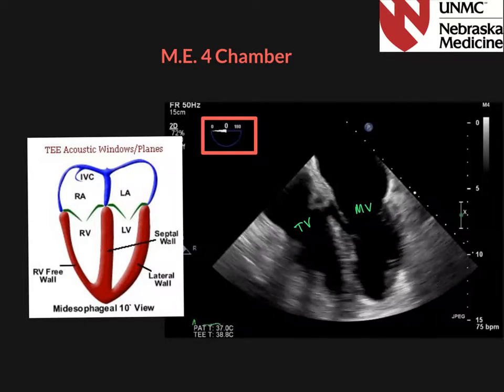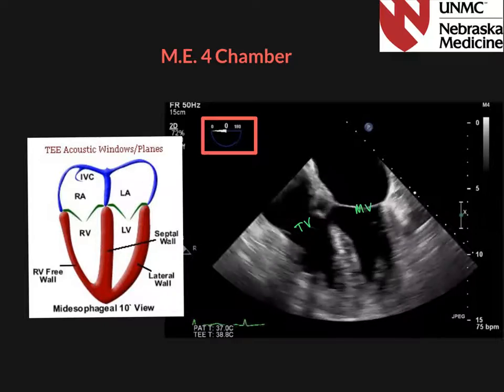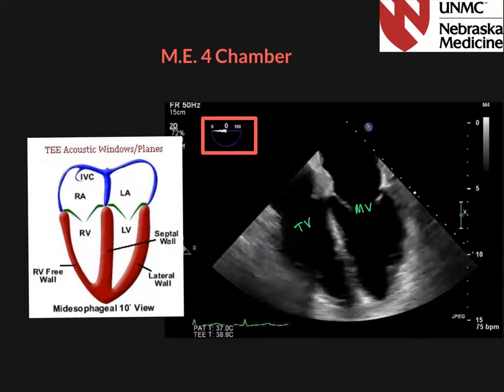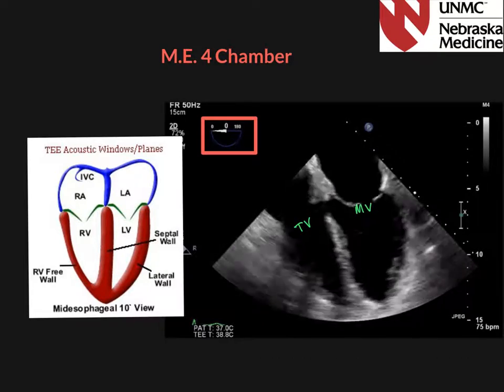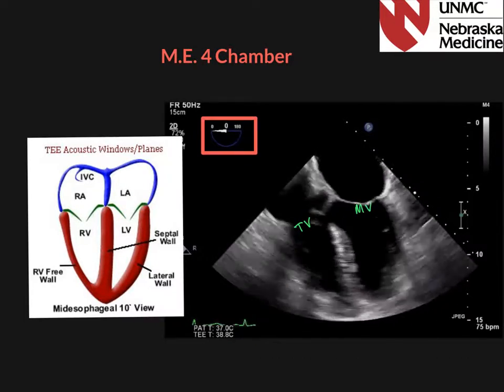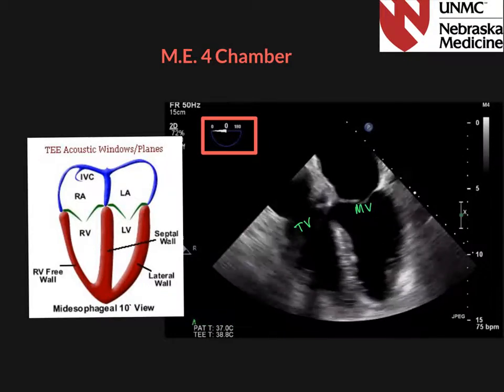of the LV. Typically, while in the four-chamber view, one should again place color Doppler on the tricuspid valve to interrogate for tricuspid regurgitation from a different angle. Next, begin evaluation of the mitral valve by placing color Doppler on it.